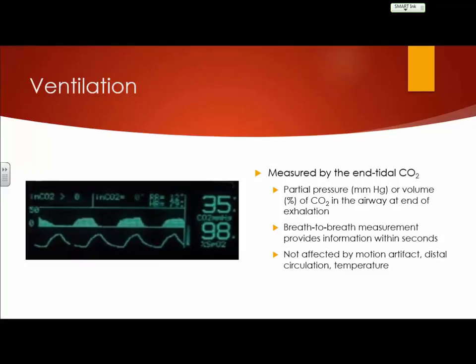But if you can imagine just for a minute that we've got the end that you put on the ET CO2 on this, all right? A couple of issues you may run into. One of them, this is a pretty flimsy tube, right? What happens in some patients when you intubate them?